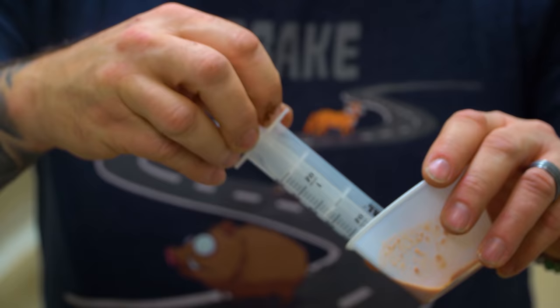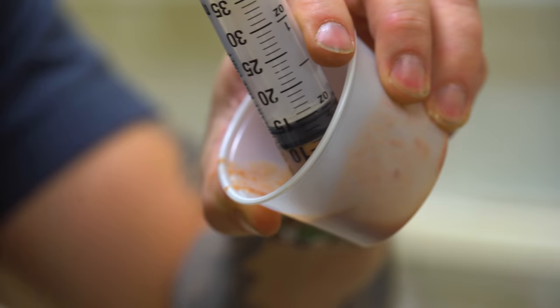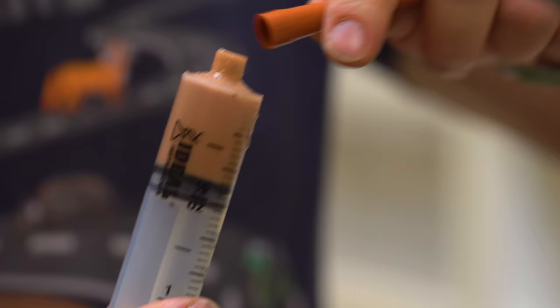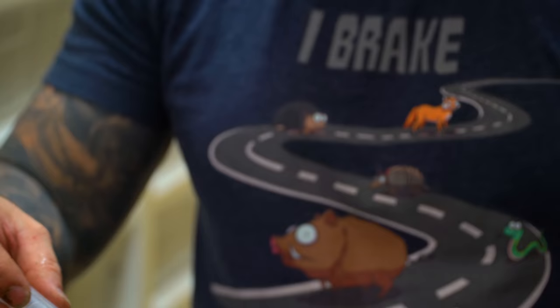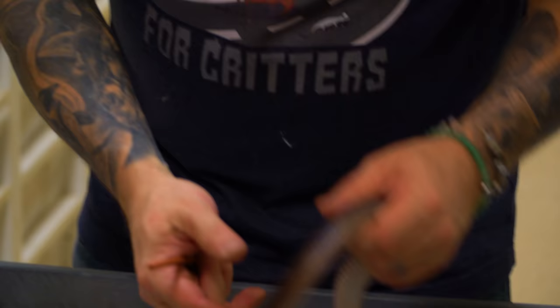So we have a nice slurry here. I'm going to take this — a 35 ml syringe — and I'm just going to suck up a bunch of this stuff. I want a pretty good amount because this is going to give it a lot of nutrition, a little medication, and more importantly hydration. I don't want air in this, so I'm going to push it all the way up, put the catheter on, and squeeze out until the solution starts to come out. I don't want to push air into the stomach.